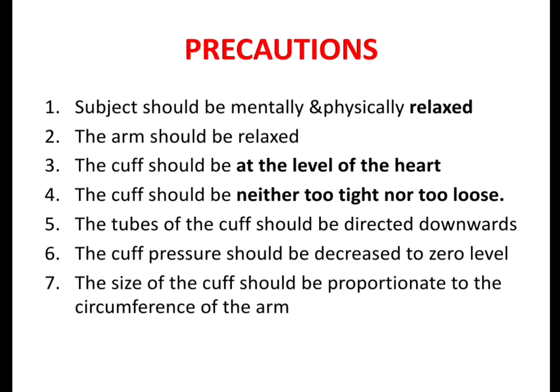Precautions. Subject should be mentally and physically relaxed. The arm should be relaxed. The cuff should be at the level of heart. The cuff should be neither too tight nor too loose. The tubes of the cuff should be directed downwards. The cuff pressure should be decreased to zero level. The size of the cuff should be proportionate to the circumference of the arm.